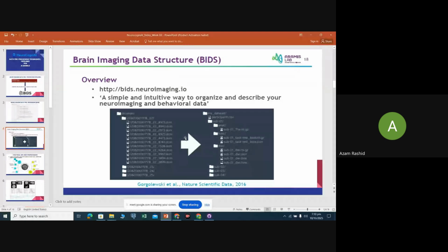In some cases, the files are 100. In some cases, it depends on the MRI settings and how the machine is set, how many slices are needed. But in the normal case, we have approximately 100 to 150 clearly visible slices in the MRI, either MRI or fMRI. And basically, this is the structure on the left-hand side in DICOM, and on the right-hand side, the BIDS structure.